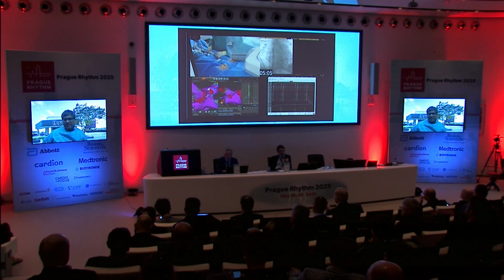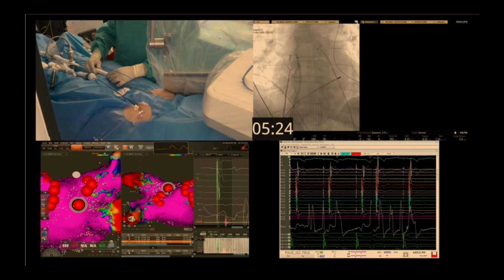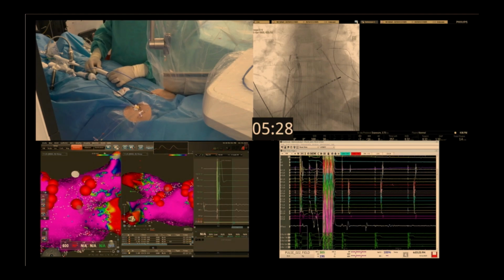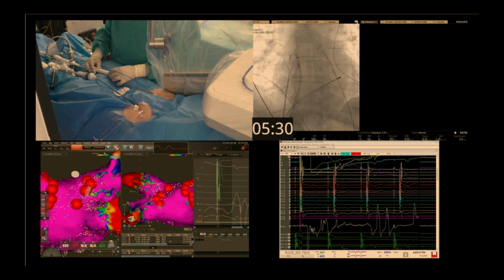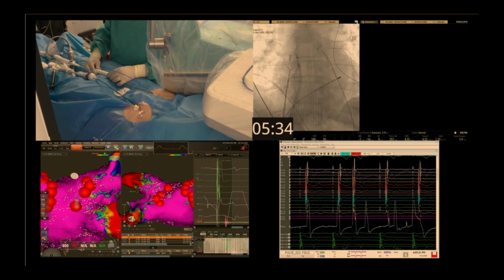Yeah, I think that, look, one of the things that we have very little understanding of, certainly with this catheter, but I would argue with all of the PF point ablation catheters, is lesion size as a function of energy delivery, right? So we need the simple dose response curves: if you deliver this dose, whether it's amplitude or duration or whatever, what is the predictable lesion size? Human data, yeah. And we don't even have good preclinical data for most of these.